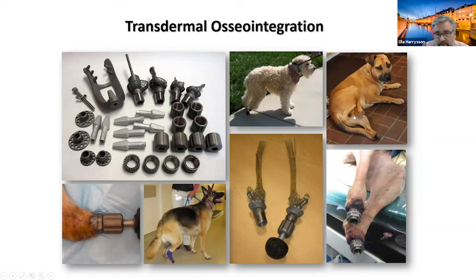Jack here was the first patient that we ever did that had a bilateral amputation on his back legs, and obviously had a very, very hard time ambulating. So we decided to do both at the same time. Here you can see the custom implants that have been fitted to 3D printed replicas of the bone itself. And here you can see right after surgery what it looks like.